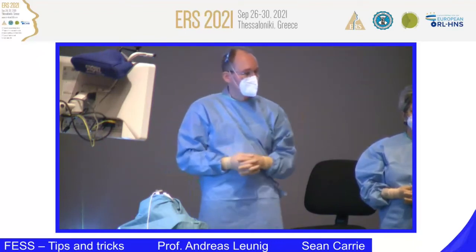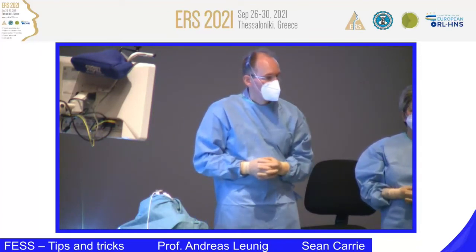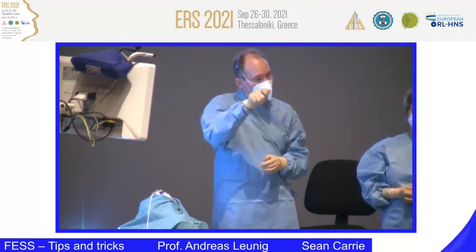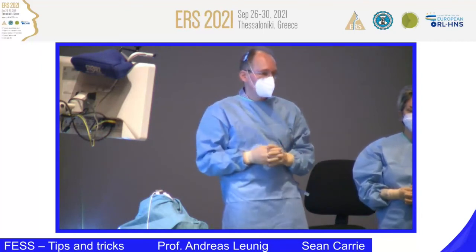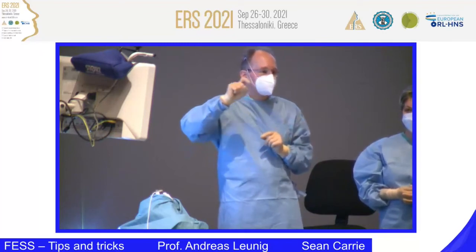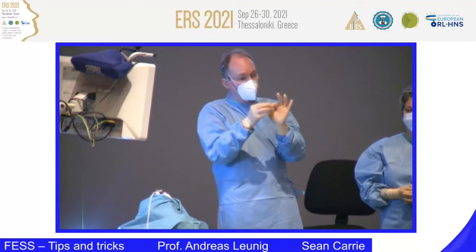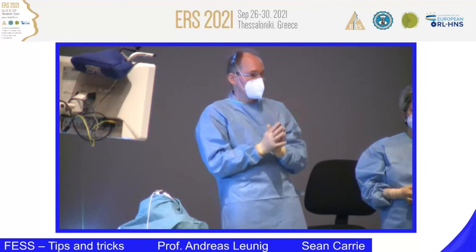Professor Leunig, in general, or in this case, do you fixate the middle turbinate transseptally? No. Never? No, I try to keep the ground lamella in place. Even when you resect the axilla of the middle turbinate, it will be stable. Of course, some exceptions may exist, but usually it works. I don't do stitching, or maybe in some single cases. I do a little bit of scratching on the medial part of the middle turbinate and the septum, so you get a little synechia, like a scar which holds the middle turbinate. So these are all tips and tricks, very helpful, thanks for your question.